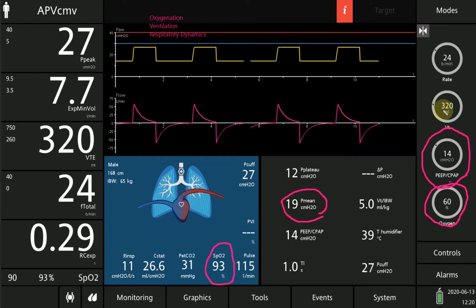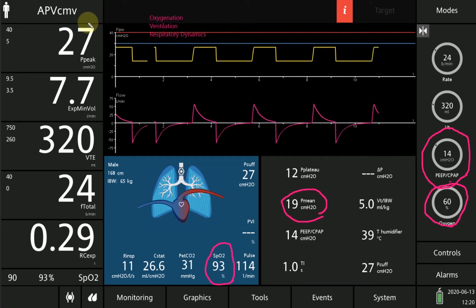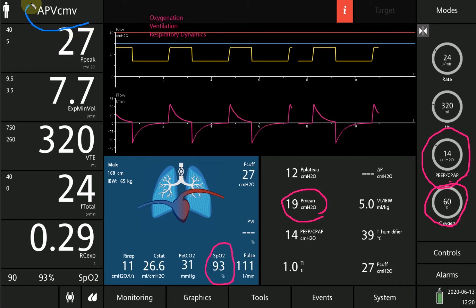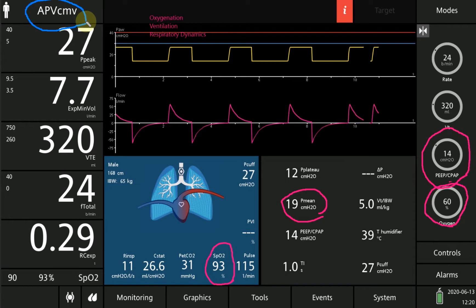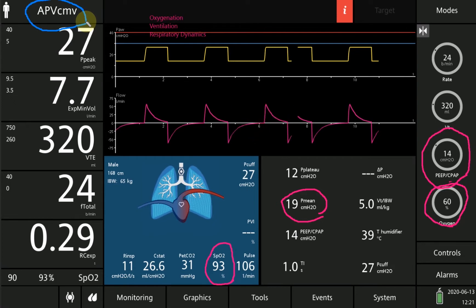The second component we assess is ventilation. This patient is on a mode called APV CMV on Hamilton, which stands for adaptive pressure ventilation CMV — equivalent to pressure regulated volume control mode on other ventilators.